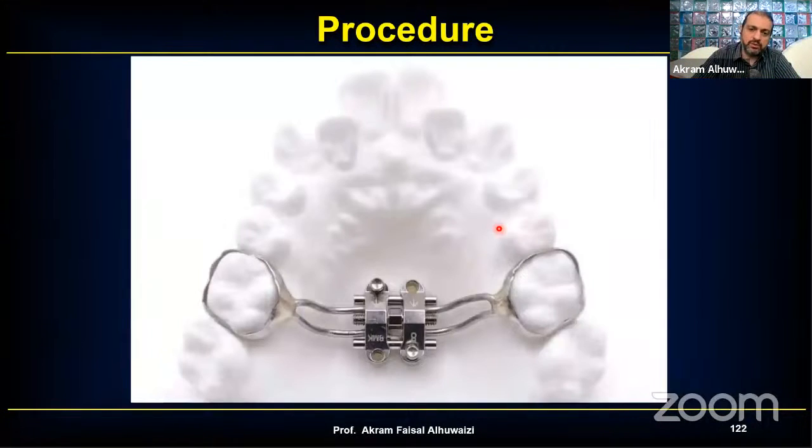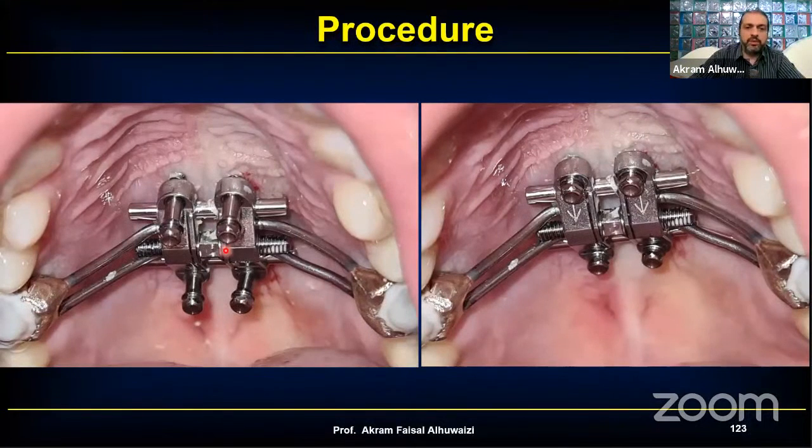So what I usually do is, of course, I would usually put contralateral ones, do one here, then this one, then this one, not to put in so much strain by doing neighboring ones. But what I usually do is I would use the handpiece and drive in the screws midway. And now that they've gone in midway, then I would use the ratchet wrench and finish off to the end. And how you know you reached the end is when you feel that there's such torsion that you're going in to the second cortical plate of the nasal cavity.